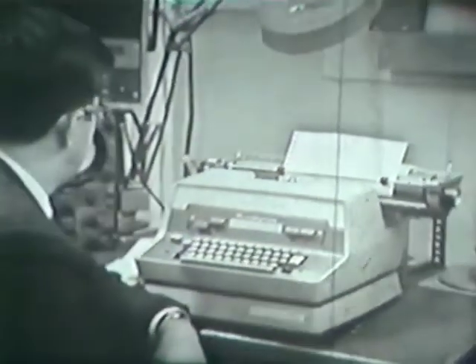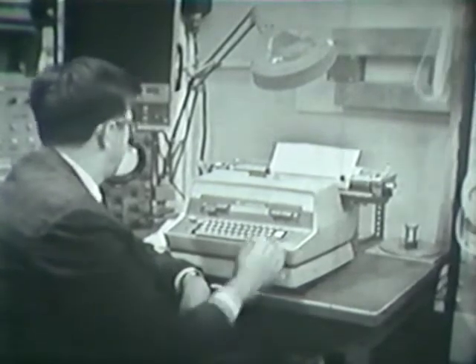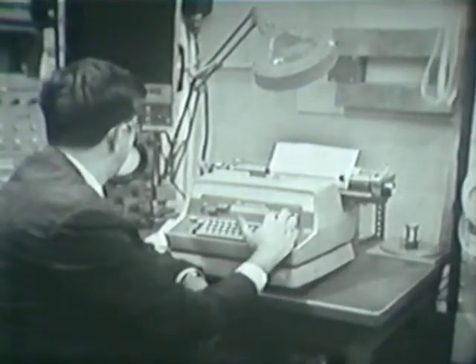H-A-S-N-O-T-D-O-N-E-S-O-A-L-R-E-A-D. You are watching a reading machine, an experimental system which uses a computer programmed to scan a printed page and translate the letters it finds into a series of comprehensible sounds. How this system works and what it may mean as a reading aid for the blind is our story today on Science Reporter.